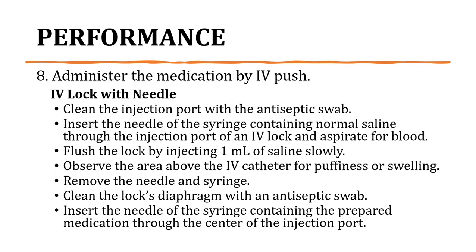Kailangan po i-flush yung lock before administration of the medication to the client para po maintaining the patency of the IV lock and flushing out the blood, the dried blood, yung mga natuyong dugo sa IV lock, and para po medyo ma-open yung blood vessel para po makadaan yung medication properly.